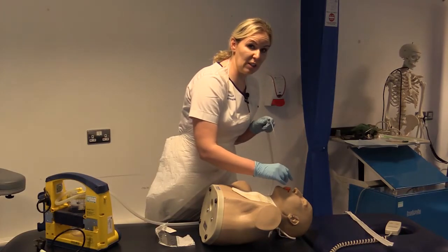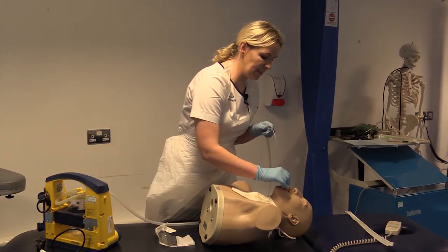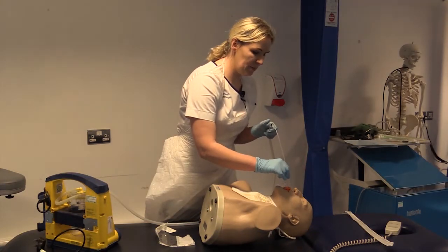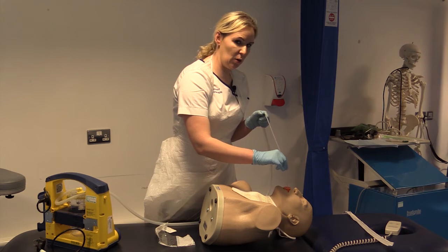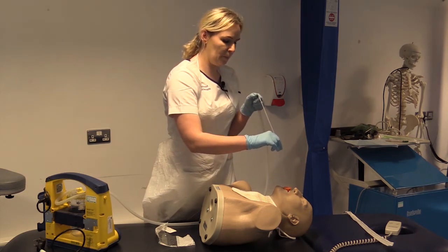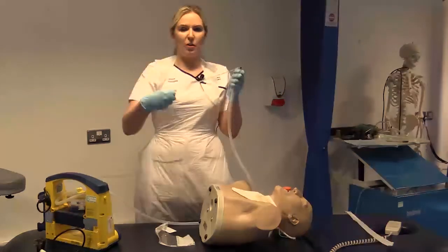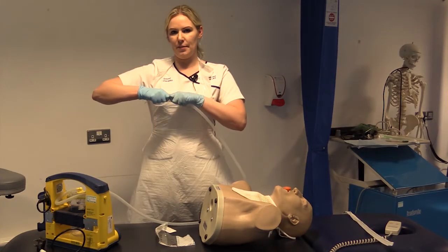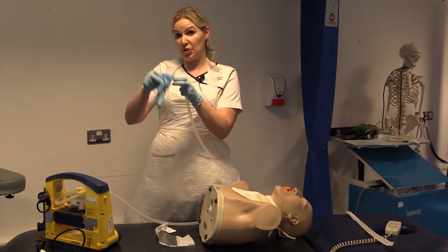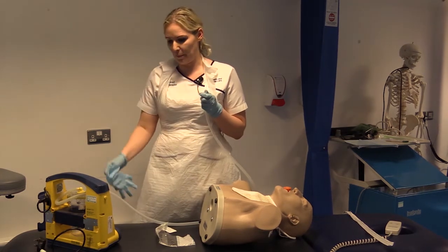Again, what we're looking for is a cough or where resistance is felt. If resistance is felt, you come off about 1 centimetre, apply your suction, and you slowly come out, making sure you're getting all secretions as you come out. Then you're going to wrap your catheter around your dominant hand, pull the lower end of your glove over the top of your catheter, and discard that in the appropriate bin.